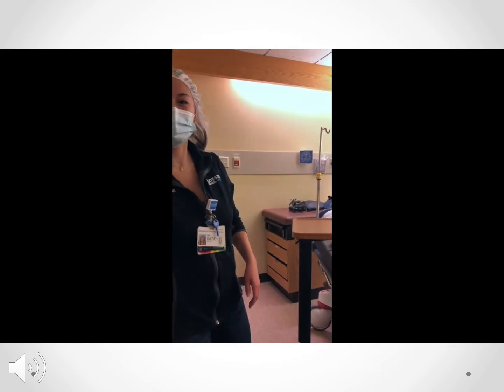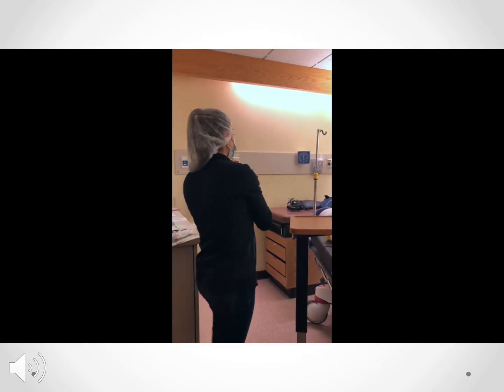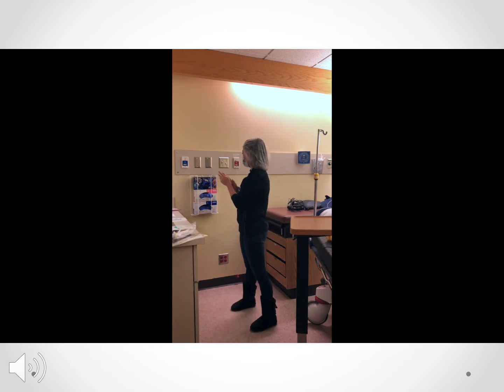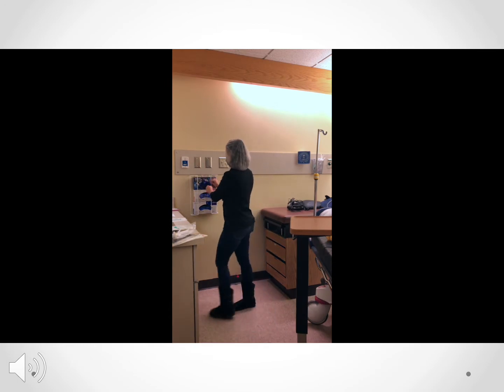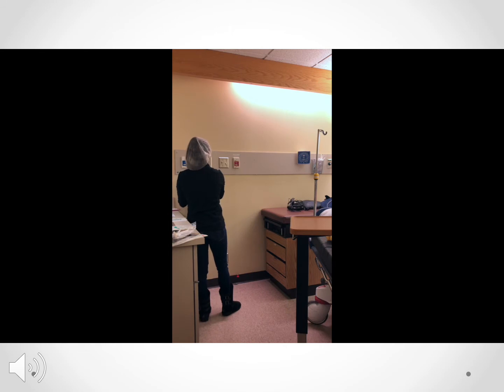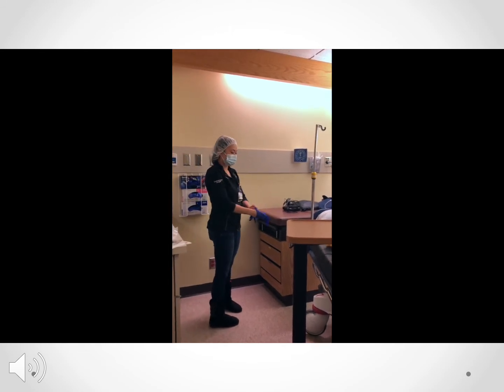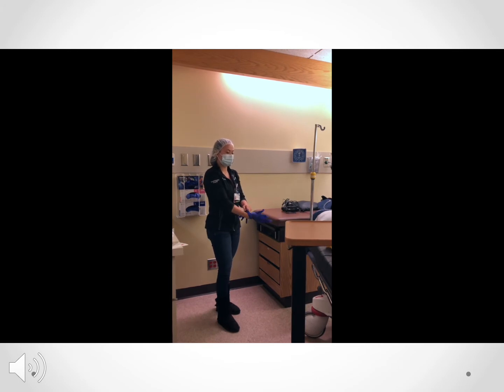We're going to be doing a sterile sternal dressing change. With the sterile dressing change, we want a sterile procedural field. We want clean and sterile gloves, sterile supplies, proper hand hygiene, and that's why we are also wearing the hairnet and the face mask.